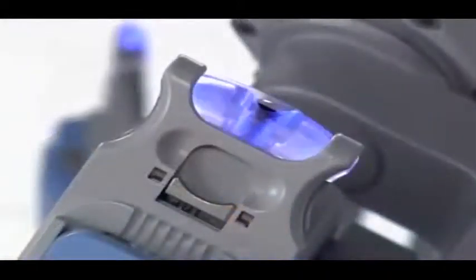Has it been a difficult transition for you to make from using your hands to now trusting a machine that's doing the work that you used to do? Well, the interesting thing is, the robot still responds to what you tell it to do. So the robot doesn't make a bad surgeon a good surgeon. And that's an important concept, really.